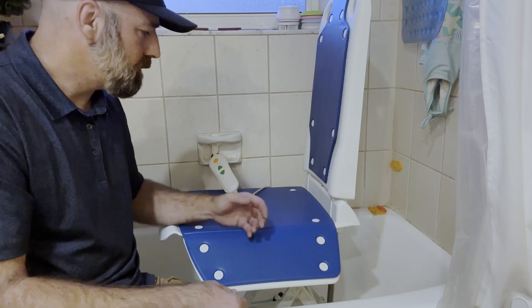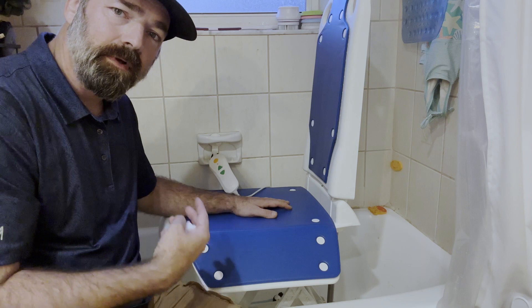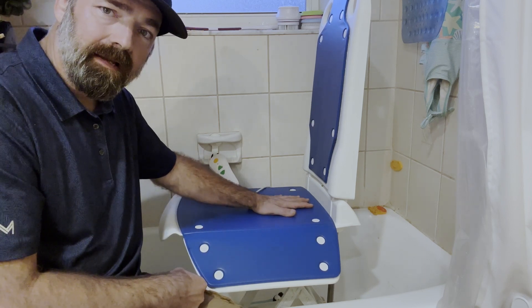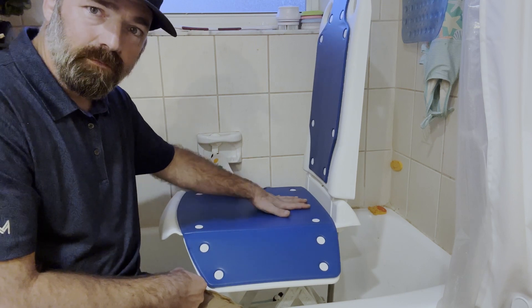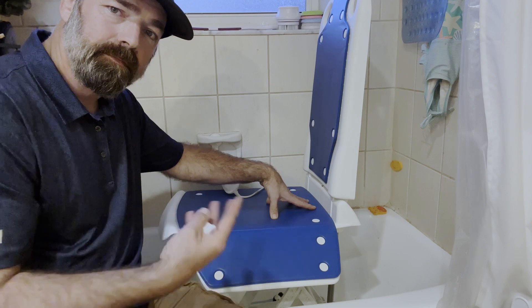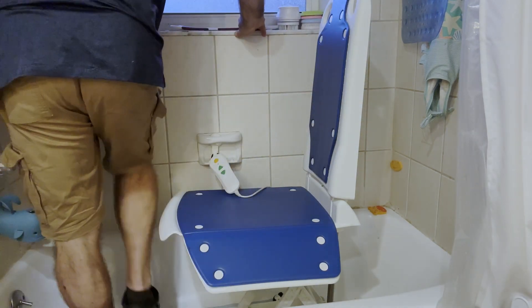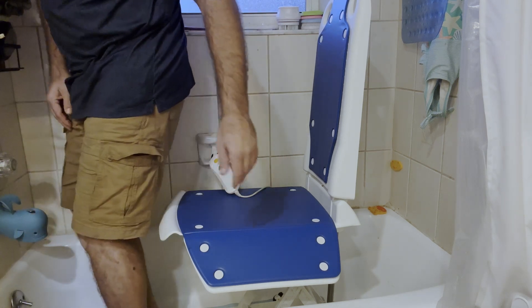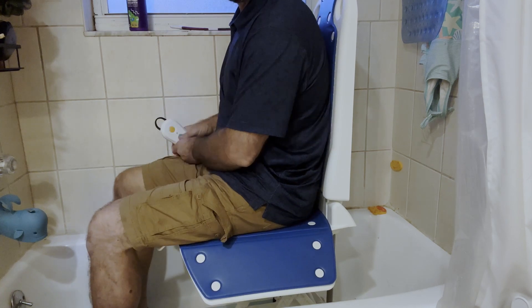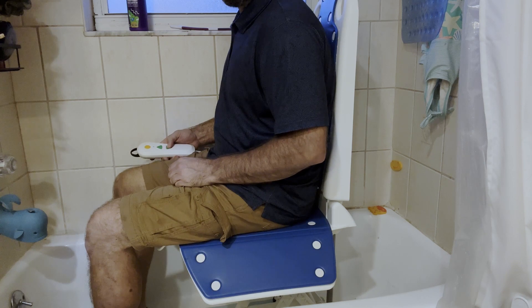I'm going to sit in the chair and show you how it works. I'm six foot one and I weigh 225 pounds, so I'm not exactly light or short, and it's quite a comfortable ride for me. If you are injured, elderly, or have a hard time getting in and out of the tub, you can just sit in the chair like you would a normal chair, then take your controller and hit the down arrow.